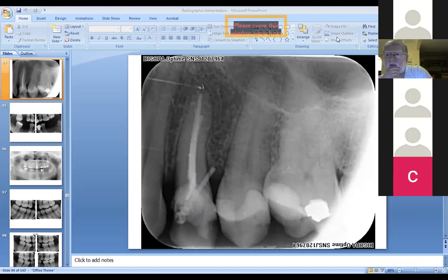When the pulp's closed up, if there's no periapical pathology, there's nothing to worry about. If there is periapical pathology, and you're going to do that yourself, you've got to make sure that you are not going to create too big an access, you're not going to deviate, you're not going to create a perforation. And if you're not confident in finding that canal, or after you've done your access, you can't find the canal, then certainly refer the patient on to an endodontist.